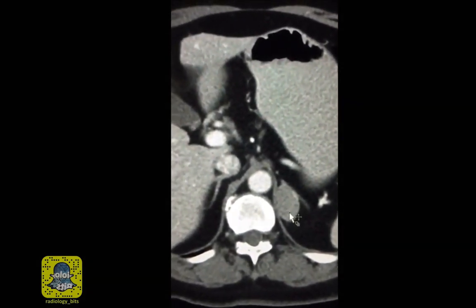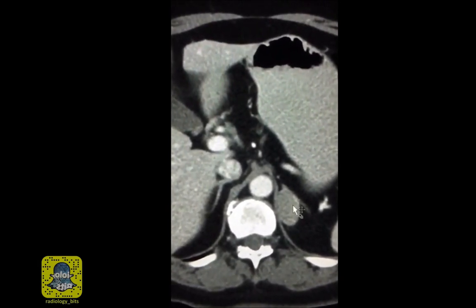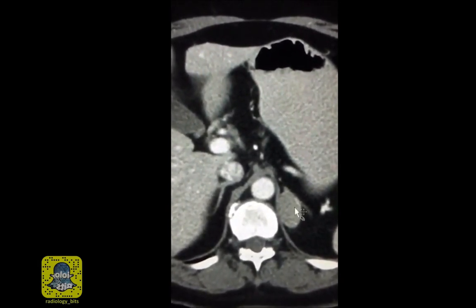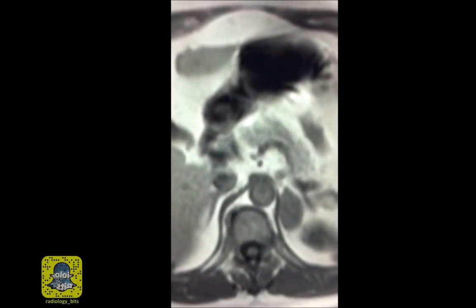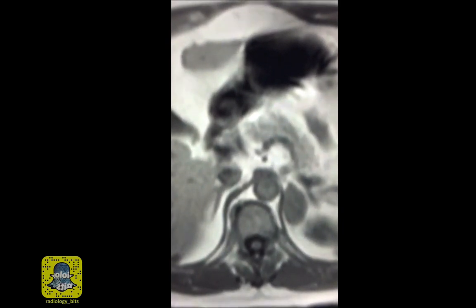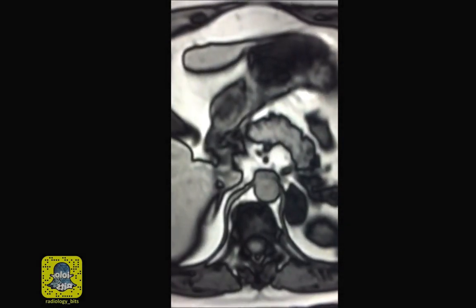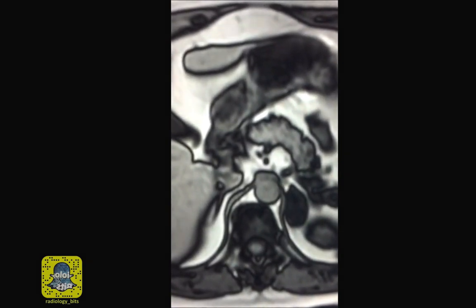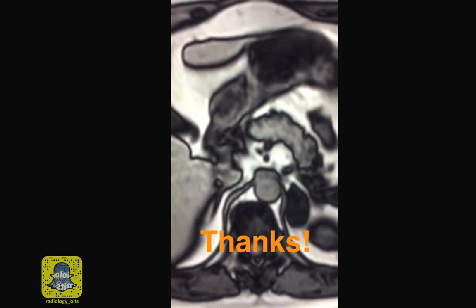However, 80% of adrenal adenomas are lipid-rich, while the rest of the 20% are lipid-poor, and for that you need an MRI. We talked about in and out of phase chemical shift T1 imaging. We understood if a lesion shows a drop of signal on out of phase compared to in phase, it contains microscopic fat. And if that's the case, it confirms a lipid-poor adrenal adenoma.